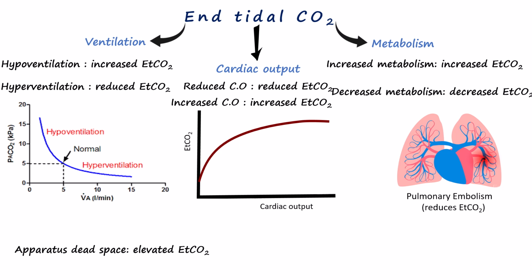Apparatus dead space includes the volume within face masks, connectors, or unnecessarily long endotracheal tubes, where exhaled gas may be rebreathed without participating in gas exchange. Additionally, in anesthesia machines, exhaustion of the CO2 absorber can also raise EtCO₂ by allowing CO2 to accumulate in the circuit.